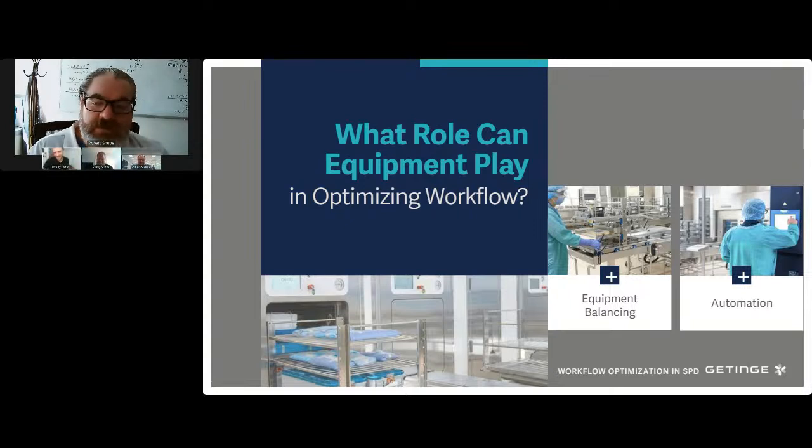But if you think about it, if you have big equipment, you have big setup time, you have big wait time, right? You have to wait until you have a sterilizer cart that has 40 trays ready to go, and then you have an hour in the sterilizer that comes out the other side, and whoever is then tasked with building the case carts and putting away that equipment now has this unbalanced workload where they just got 40 trays all of a sudden, and they haven't had trays for maybe the last 45 minutes.